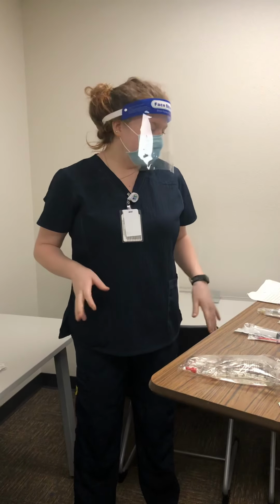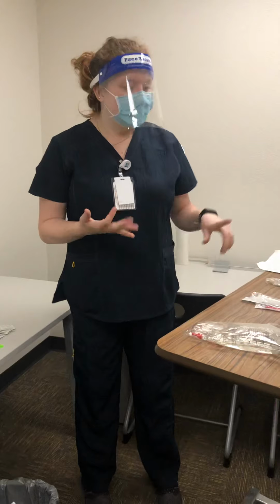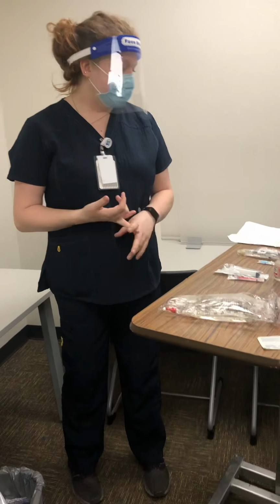My name is Jessica Martin. I'm an ABN student at Williston State College. Today I'm demonstrating my week 5 skills, which are an IV medication push and an IV bolus administration.